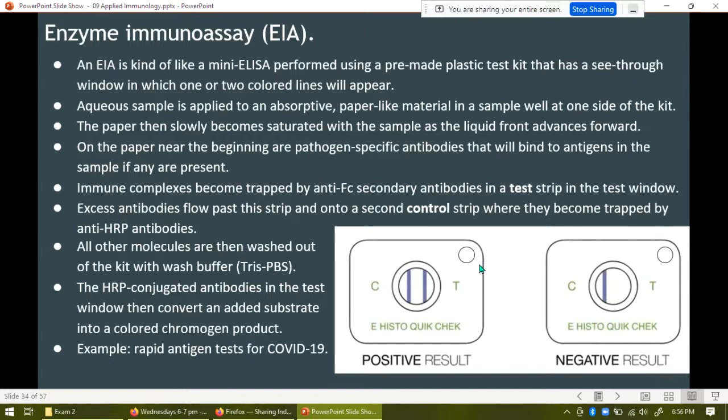And, you know, I guess it probably costs a little bit less money. You need less expertise to do it. You can do it for cheap. You can mass produce these. They're really small. You can mass produce these for almost no money and then charge, you know, $20 for it and probably make $19 in profit, because it really is just a piece of plastic, a piece of paper, and some antibodies and some saline. I mean, really cheap stuff.